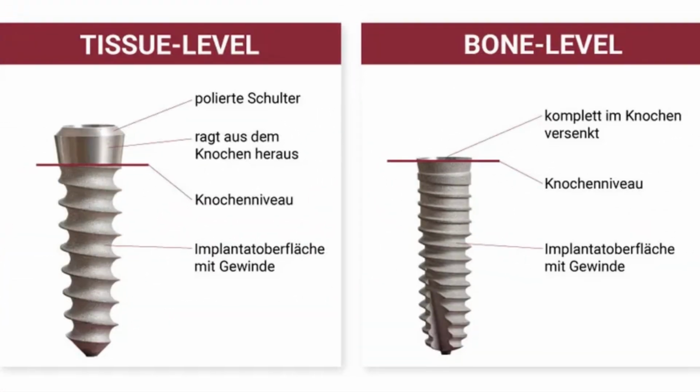Or it may be tissue level implants. If the vertical height is less, you can use a tissue level implant. There are a lot of variations, so choose your implant very wisely. Don't choose your implant based on marketing.